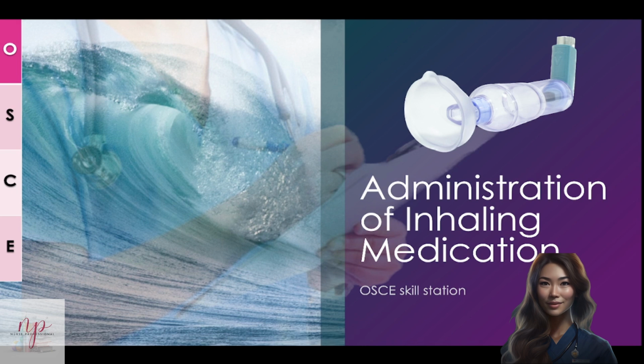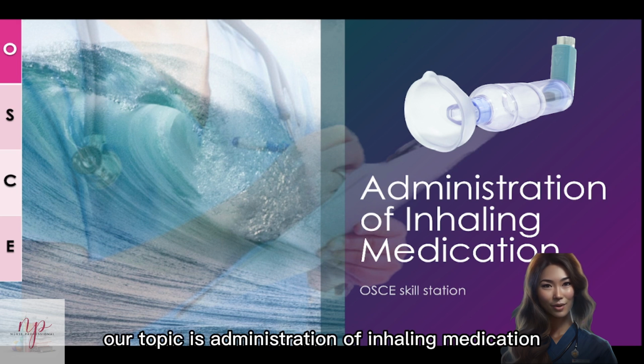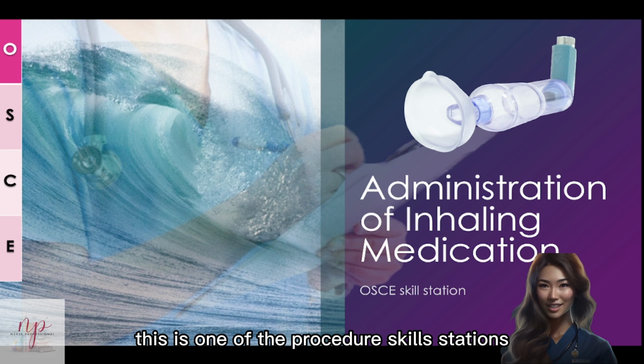Alright, so today our topic is administration of inhaling medication. This is one of the procedure skills stations.